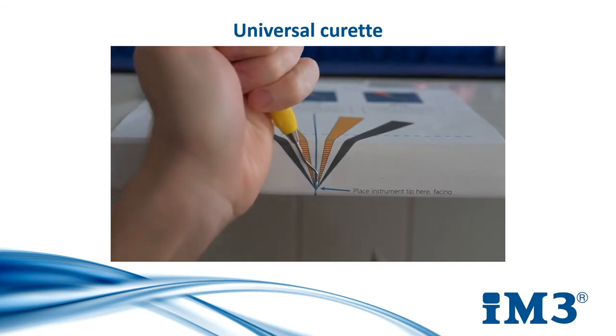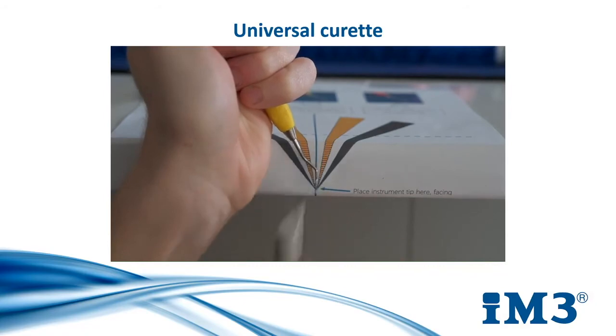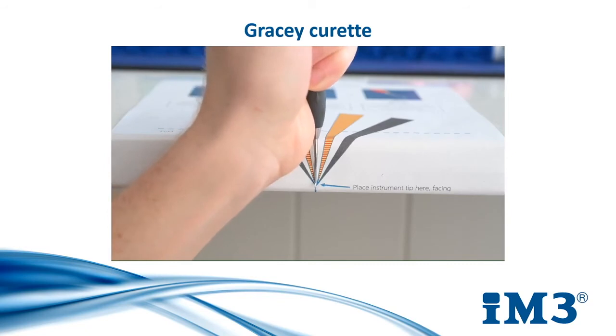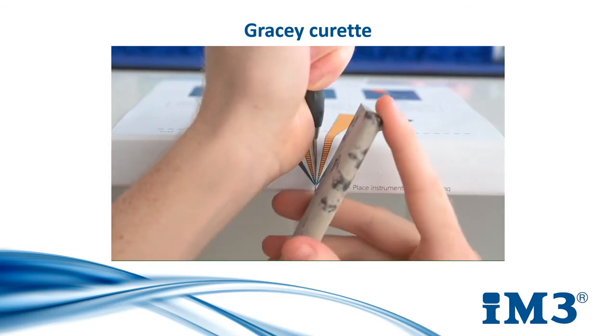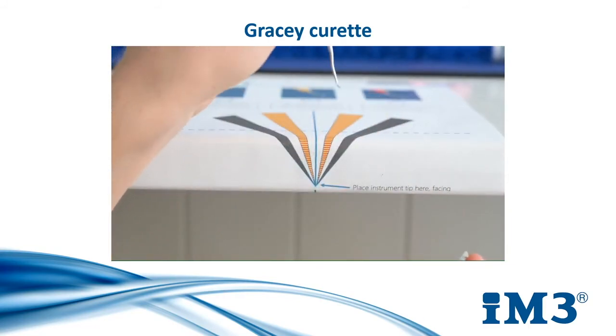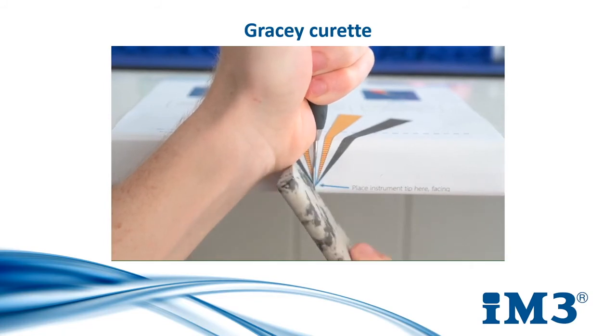As for the universal scaler, the universal curettes also has a 90-degree face and so it is sharpened using the yellow and red marked zone as well. For a Gracie curettes, we will use the same technique as for the universal curettes and universal scaler, however we will position the stone in the grey marked zone. This will comply with the 70-degree angle on a Gracie curettes. For all three instruments we will need to sharpen each of the blade faces on both ends and on both sides. On a Gracie curettes, however, this is only one side per end.